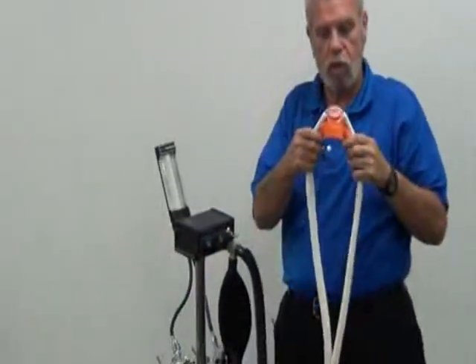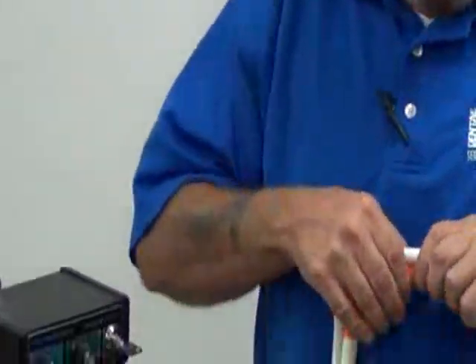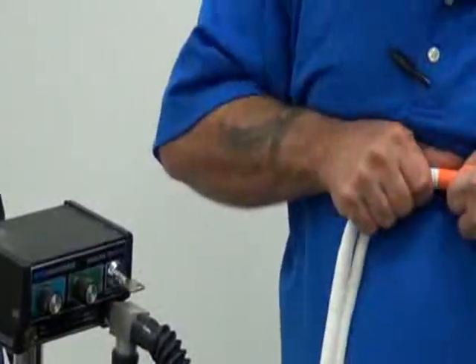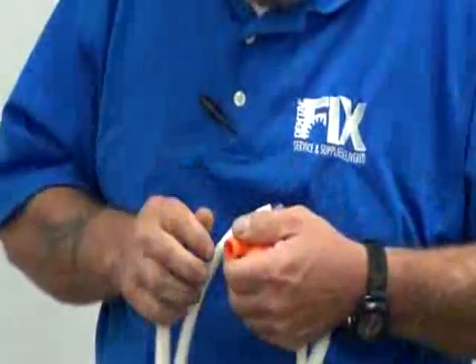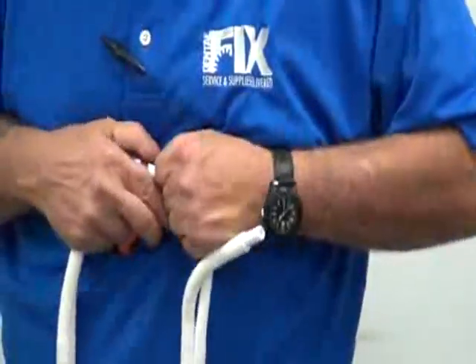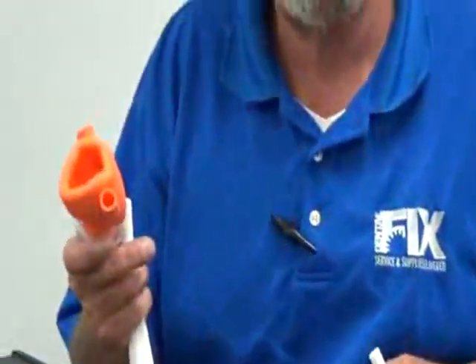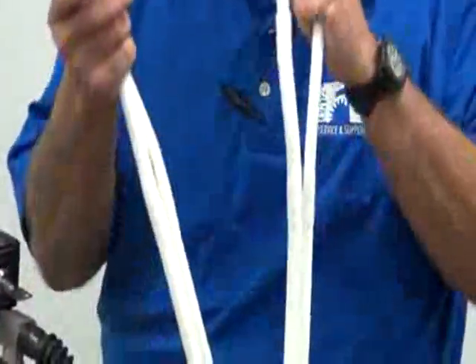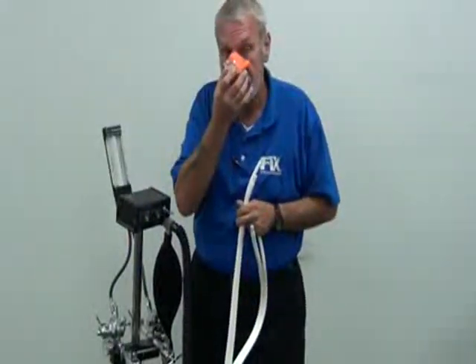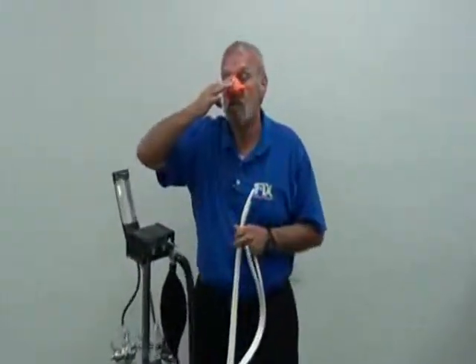On the end of the rubber goods, you have a nose piece. This nose piece is interchangeable with the rubber goods. Now, they make disposable nose pieces, or the doctor can elect to use the same nose piece for every patient. They make them in different sizes. They make them adult large, adult small, adult medium, and they make them pedo for children. You want the nose piece on the patient like this, so that the oral cavity isn't covered, so the doctor can still do his procedure.